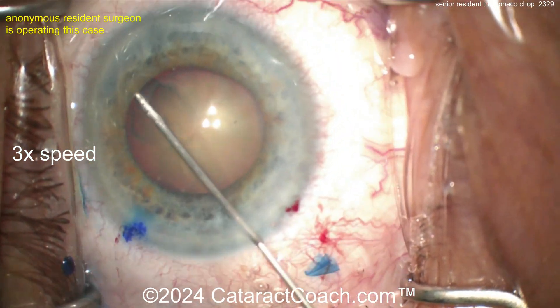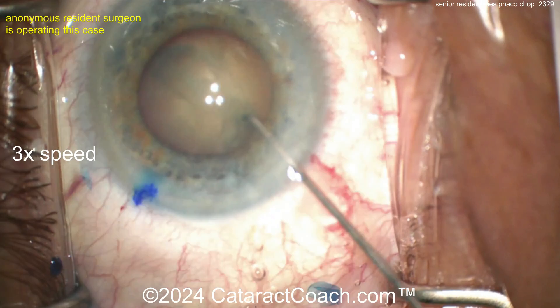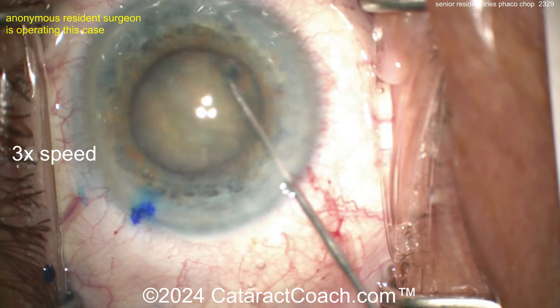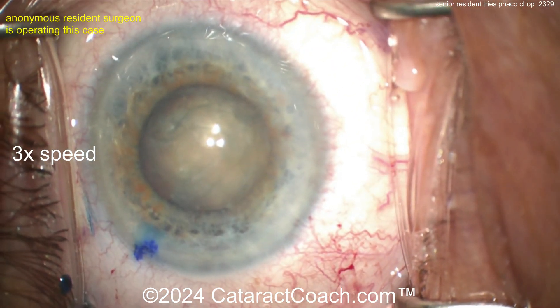I'm guessing this resident has done at least a hundred cases. Now some hydrodissection using that specialized cannula — get that nucleus to spin. As we know, if it does not spin you will not win. That spins, so you're going to win — it's going to be good.